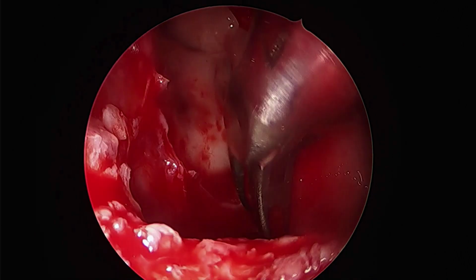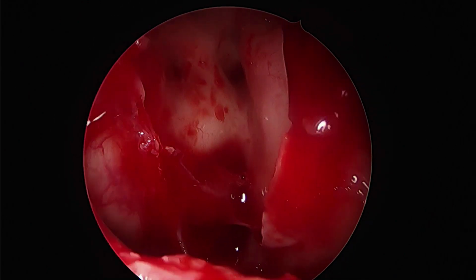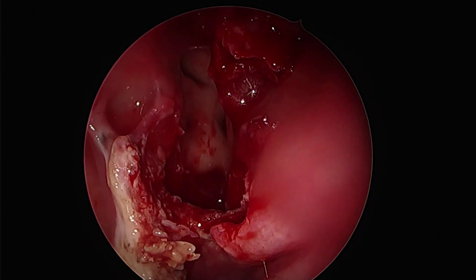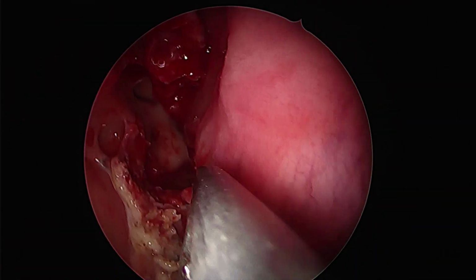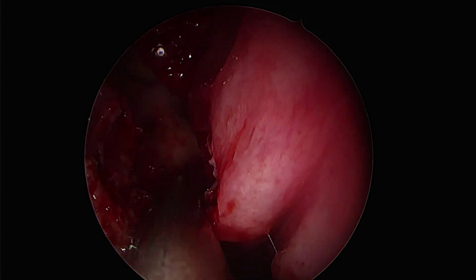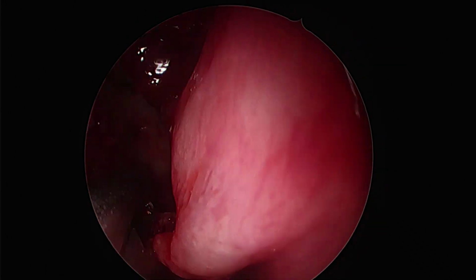Now one can see that with a slight angulation we are able to achieve nearly a complete takedown of the septations and convert both the sinus cavities into one, akin to probably how we manage a mastoid cavity as well. Just because our angulation was still limited, we are trying to see if some more bone removal can give us a little bit more instrument leeway inside the sphenoid.